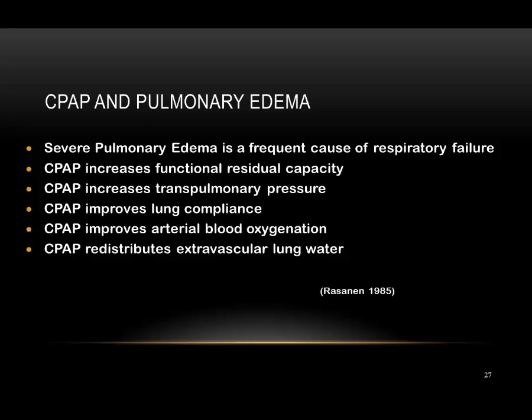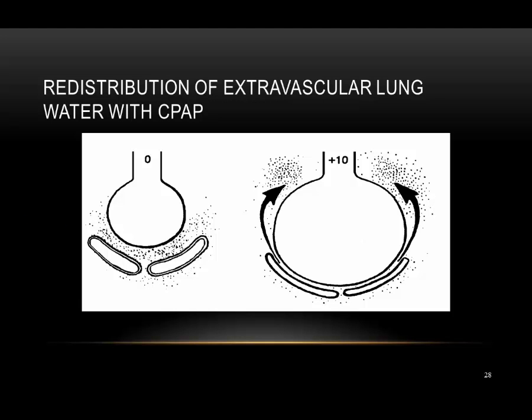CPAP increases FRC, increases transpulmonary pressure, and improves lung compliance. 10 centimeters of water improves arterial blood oxygenation, and it redistributes extravascular lung water. The application of PEEP to lungs with edema decreases the intra-alveolar fluid volume, increases interstitial lung water, and facilitates the movement of water from the less compliant interstitial spaces where gas exchange occurs to the more compliant interstitial spaces.